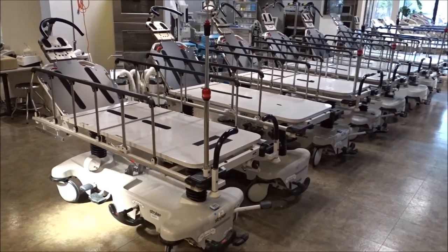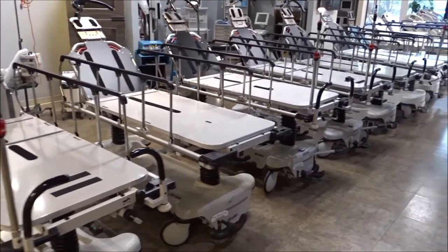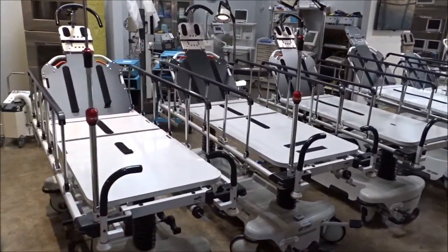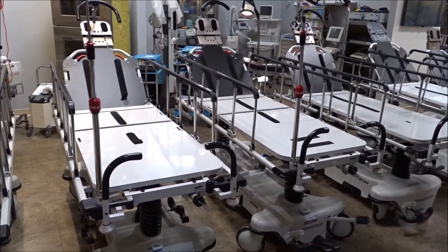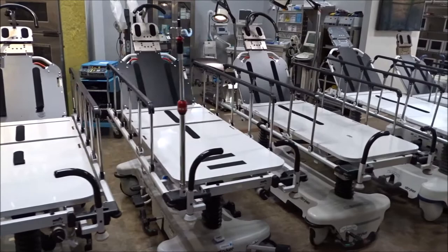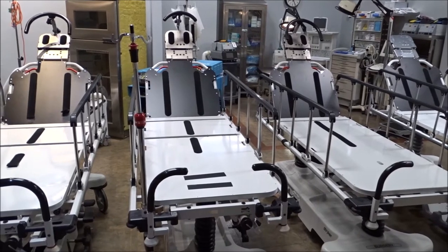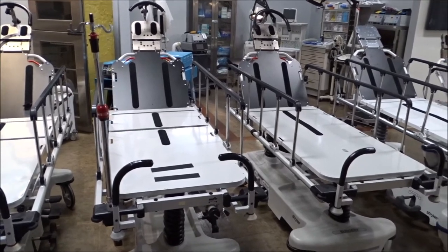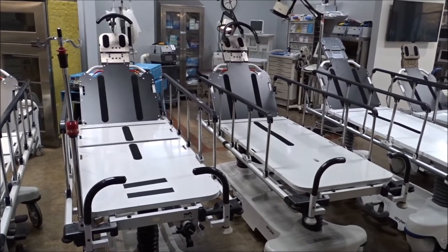For more information on the Stryker 1068, 1069, 1079, and 1089 stretchers, give us a call at iMedical Equipment and Service. We provide these to hospitals and surgery centers all over the world. You can reach us in San Diego, California at 858-263-4894, or in Richmond, Virginia at 804-929-6886. You can get more information on our website at www.iMedicalShop.com. iMedical Equipment and Service — we are your one-stop shop for all your eye stretcher, gurney, and medical equipment needs.